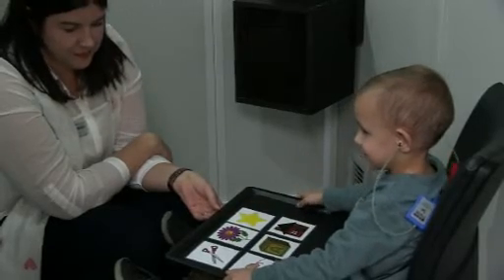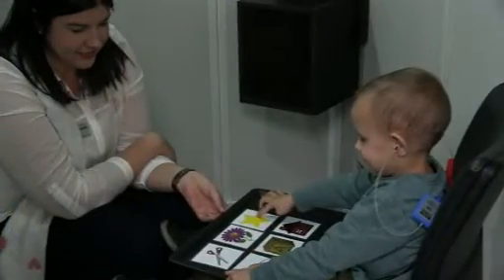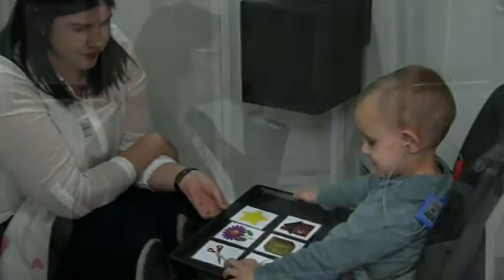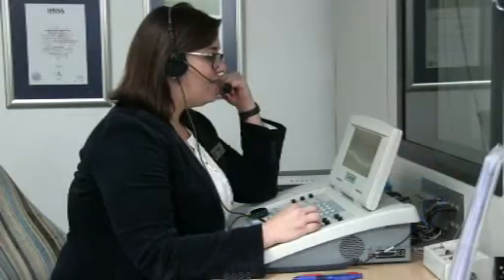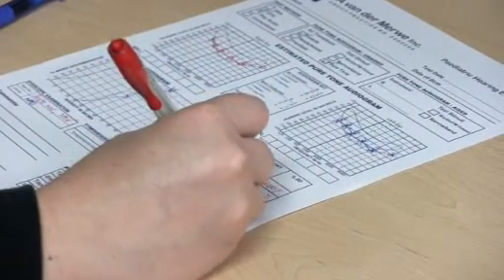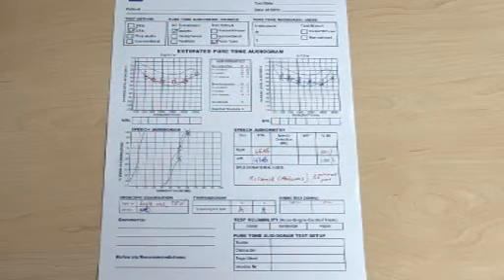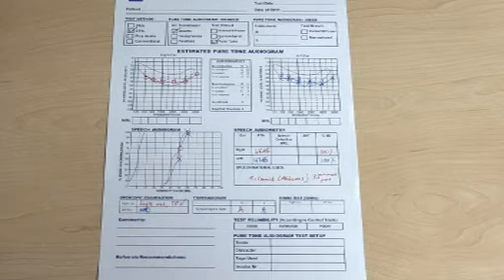The testing is complete if a maximum score of 100% words correct is reached. For example, if 4 minimal pairs were used, 8 correct responses should have been obtained. If the child is not able to reach 100% at a certain intensity, increase the presentation level with 10 decibel increments until 100% is reached. Remember to use different minimal pairs to prevent the learning effect. Document these results on your pediatric audiogram at the speech audiometry section and note the number of minimal pairs used.